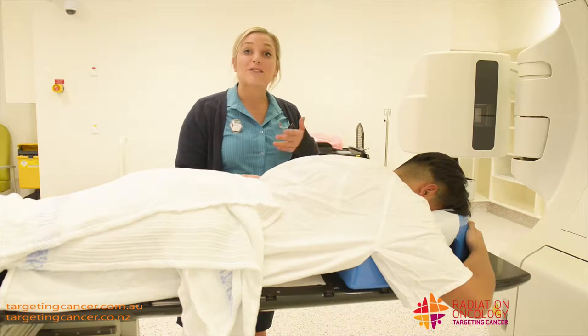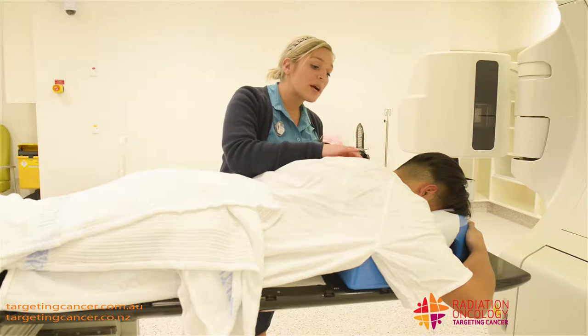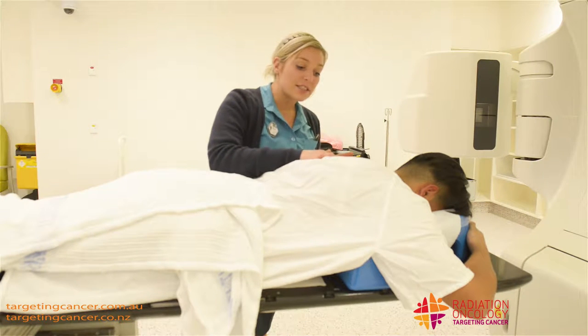Once we have our patient on the bed, we have to make sure that they're in the correct position. I'm going to feel for a couple of bones to make sure that John's nice and straight.